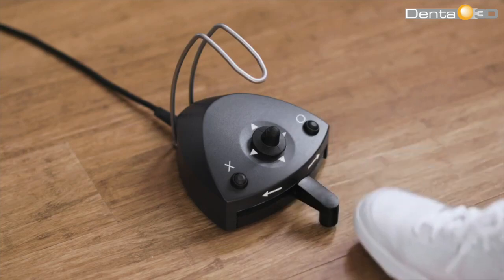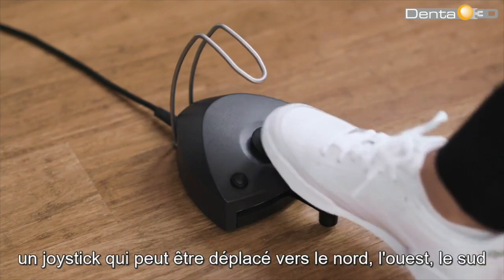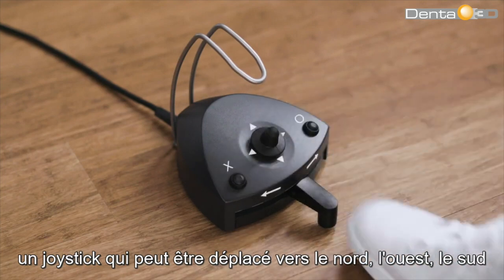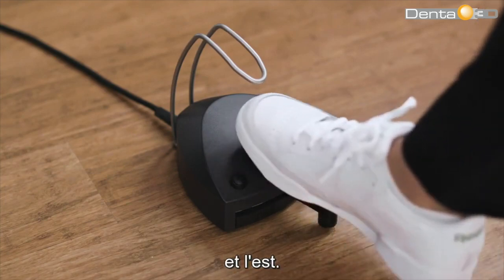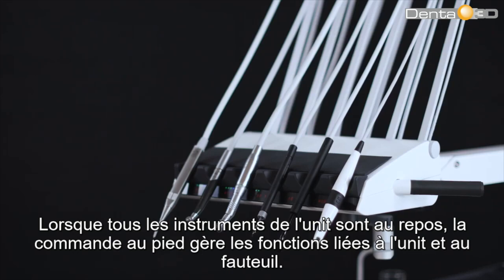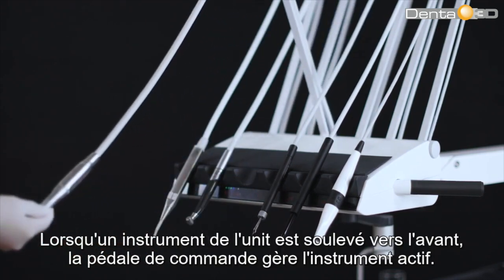The foot control also includes a joystick that can be moved north, west, south, and east. When all unit instruments are at rest, the foot control manages functions related to the unit and chair. When a unit instrument is lifted forward, the foot control manages the active instrument.